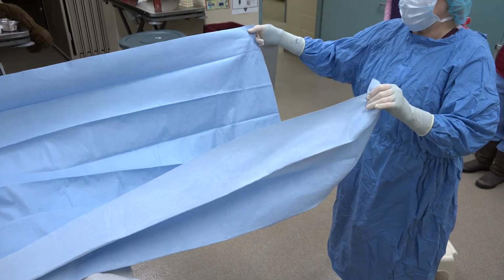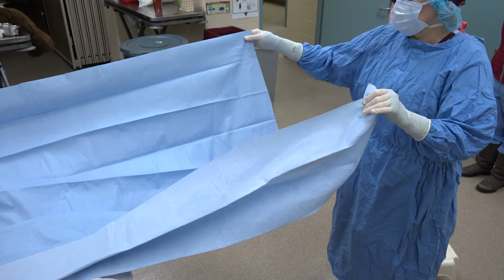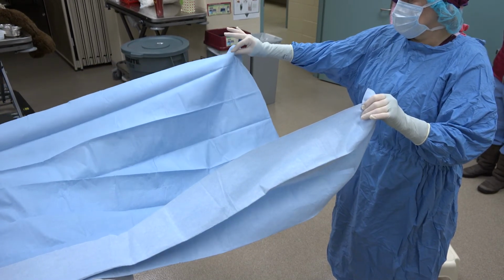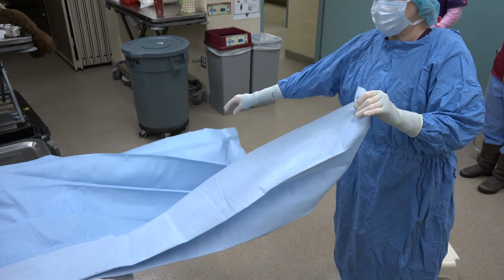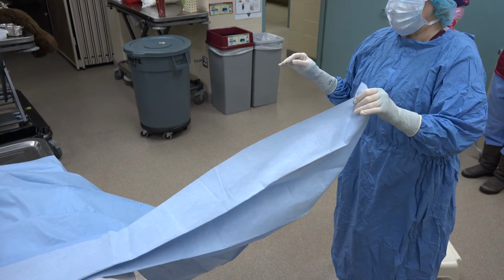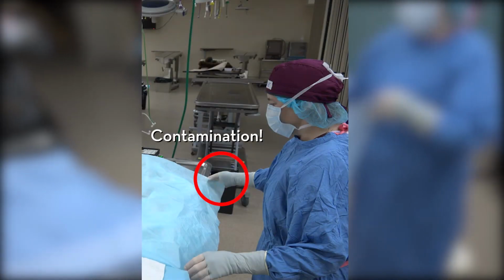So Sue's hand is now under. If she goes below her waist, it's contaminated. So you either switch your hand to the top and then let it down, or you just drop it up high. So those are your two choices. But if you go down below your waist with your hand underneath that drape, it's contaminated.